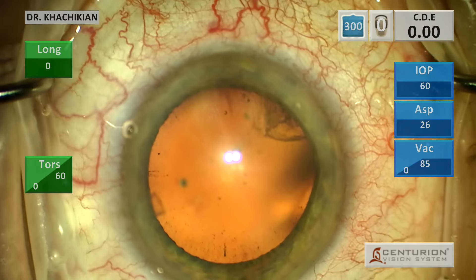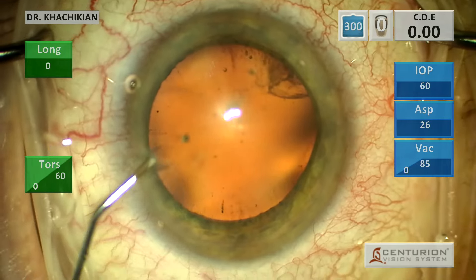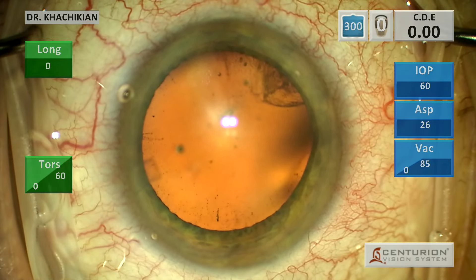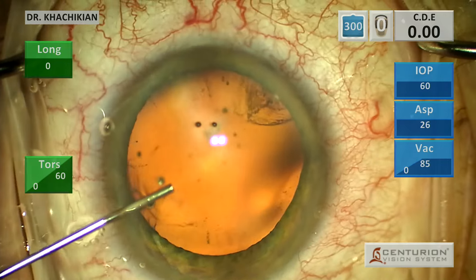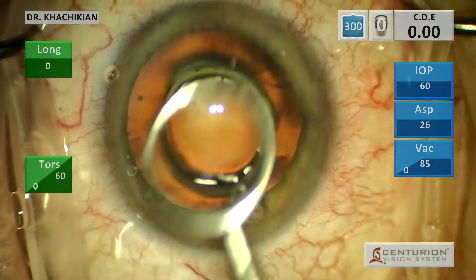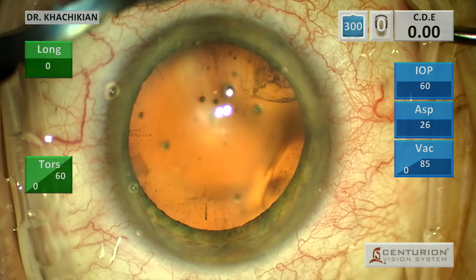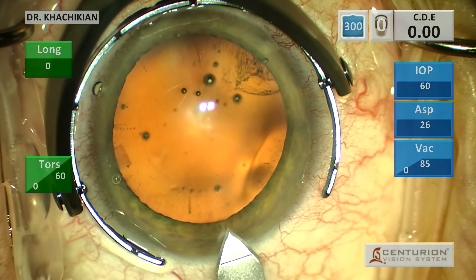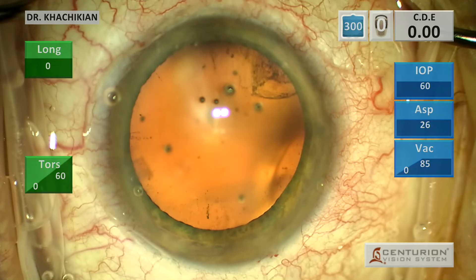This is a little bit of a denser cataract we did in the last week or so. We'll make our side port, a little bit of lidocaine, and then we will place our viscoelastic and see if we get a good fill here. That is pretty nice. Don't forget to wiggle the cannula on the way out to get some of those bubbles out if you need to. We'll make our five millimeter mark on the surface and make a nice square incision. When I put that stabilization ring down, I put the spikes up so that we don't create any subconjunctival hemorrhages.